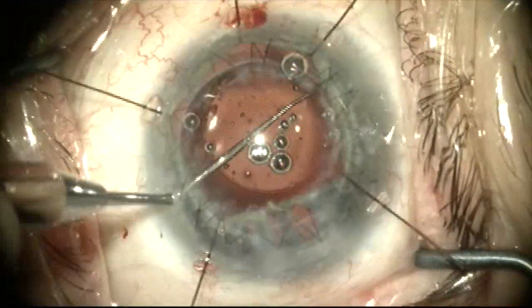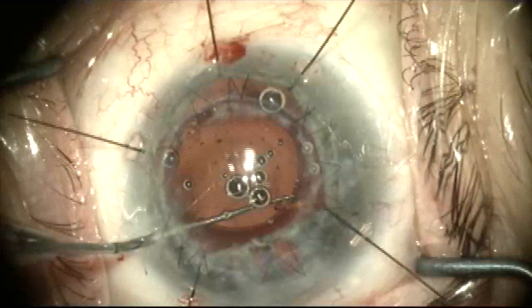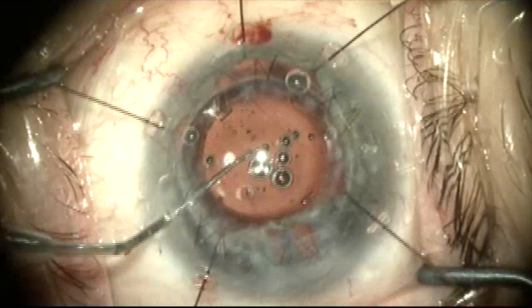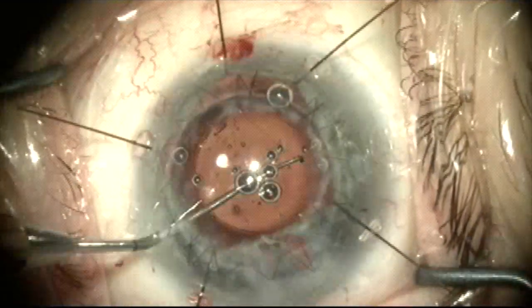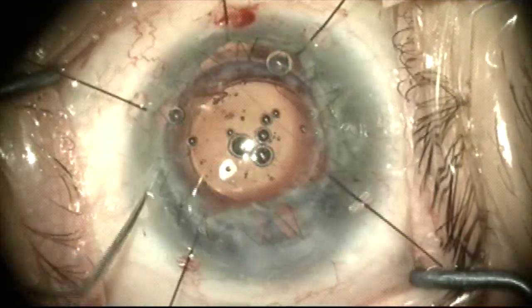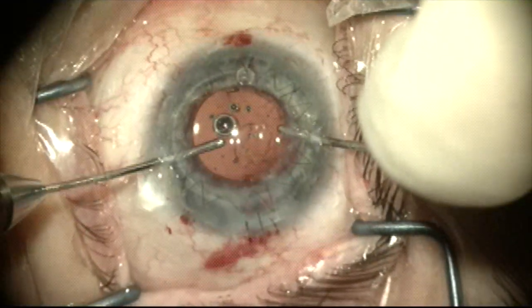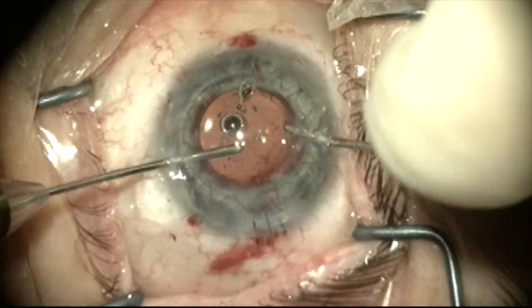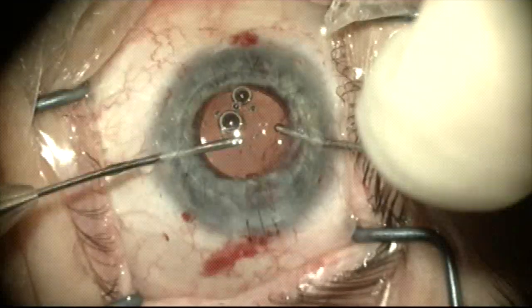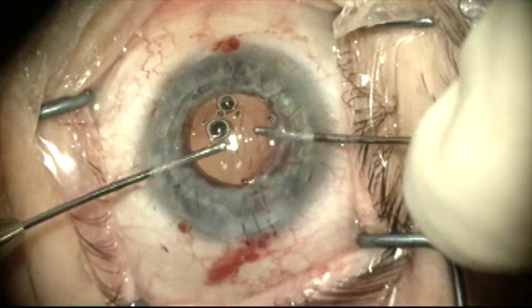I'm now going to gently rotate the lens into the position that I feel it is least likely to end up within the portion of the damaged capsule, but within and supported by the capsule bag. Once this is done and I feel that the lens is secure, I've removed the iris retractors, placed three sutures in the incision to secure it, and now I'm going to remove the residual viscoelastic with a pair of separate irrigation and aspiration hand pieces.